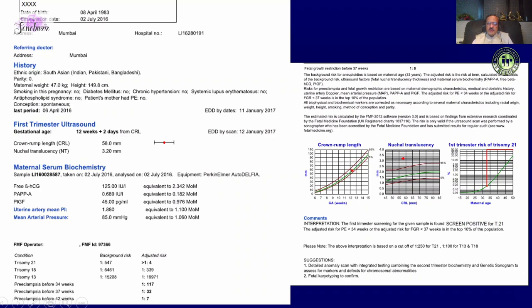Adding PlGF may improve your pickup rate for preeclampsia slightly. Here we have done biochemical markers and an NT scan with mean arterial pressure and uterine artery PI, and we see that the risk of preeclampsia in this case is high. Interestingly, the risk of trisomy 21 was also very high.